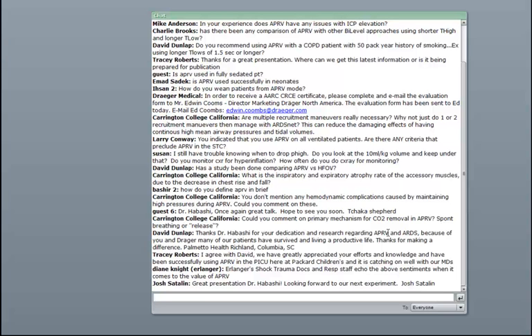The next question is, can you utilize a timed release approach to paralyzed patients? I think the answer, if I understand it correctly, is yes, you can, because remember that instead of setting a rate, you are essentially indirectly doing that by creating a cycle time. The T high, let's say, is 5.5 seconds, and the T low is 0.5 seconds. That's a total of 6 seconds. That's a rate of 10. So your patient isn't going to become hypercarbic. So you can use it in post-operative patients, in brain-dead patients. You actually get a lot of ventilation during the releases. And as I mentioned, there is probably a combination of diffusion and convection going on with this mode of ventilation.